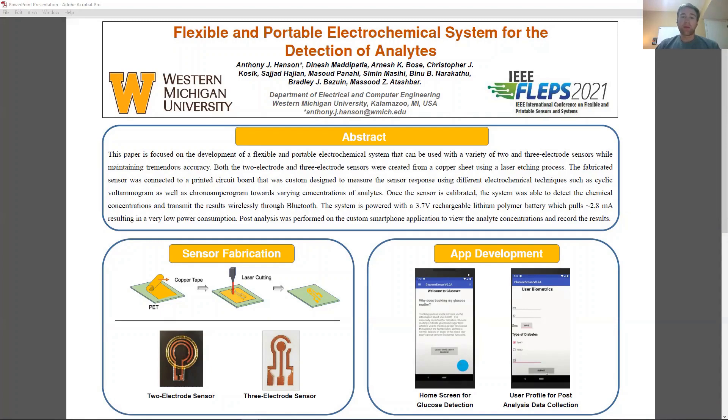A custom app was designed and developed using Android Studio for monitoring glucose levels of a diabetic patient. The application stores the user's biometrics and their test results from the system. The blue circle on the home screen shows that the electrochemical system is connected through Bluetooth Low Energy.